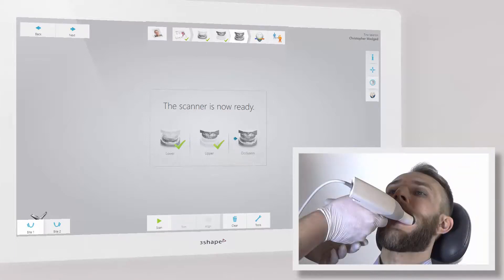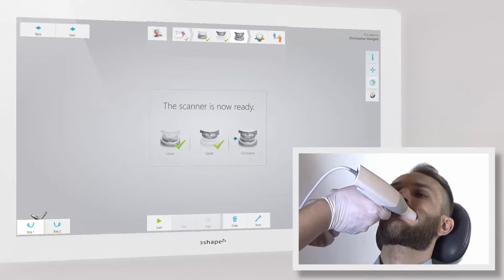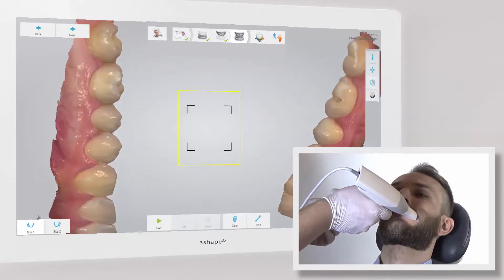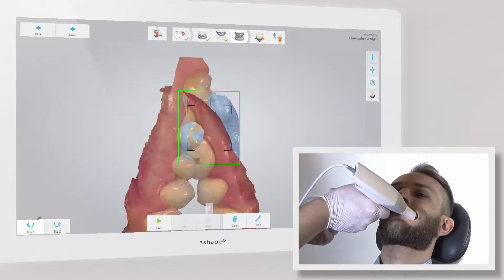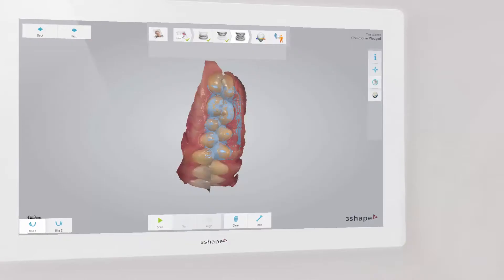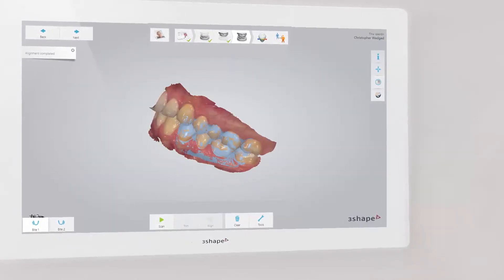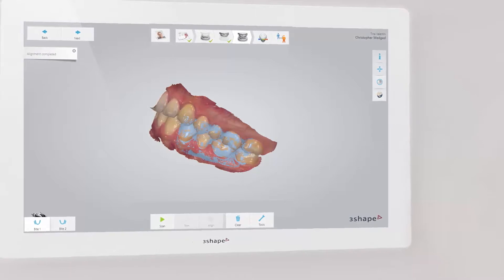Ask the patient to bite in centric occlusion. Start the scanner — the scanner tip will hold out the cheek. After a few clicks, slowly move out the tip while scanning. Keep scanning until both arches snap into position. Scan 3 to 4 teeth for perfect alignment, even if the scan snaps together earlier.